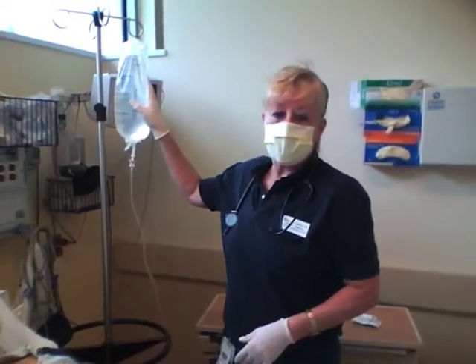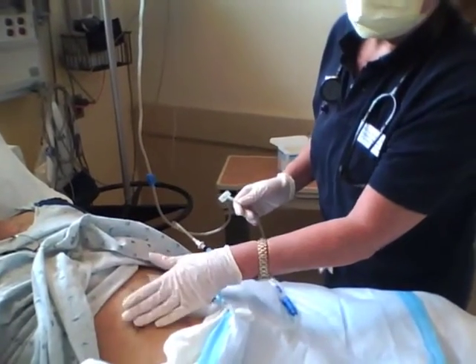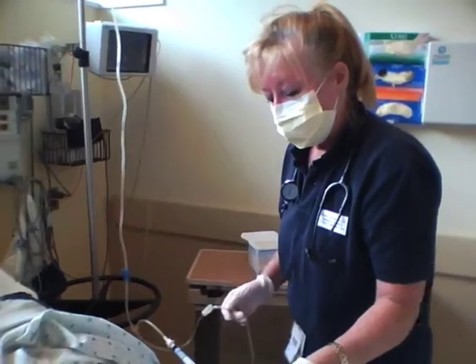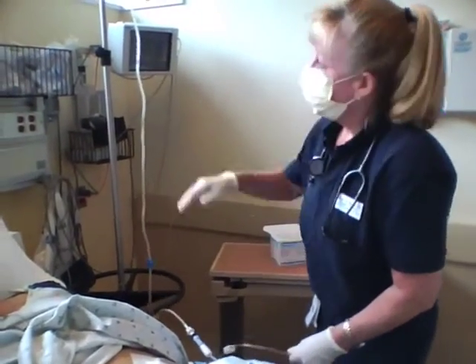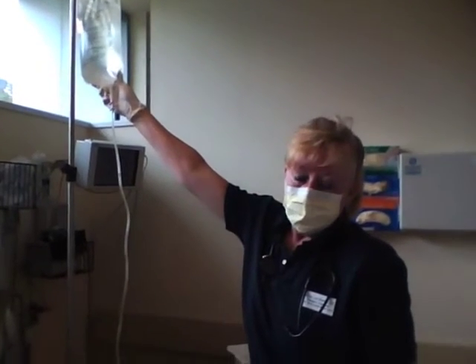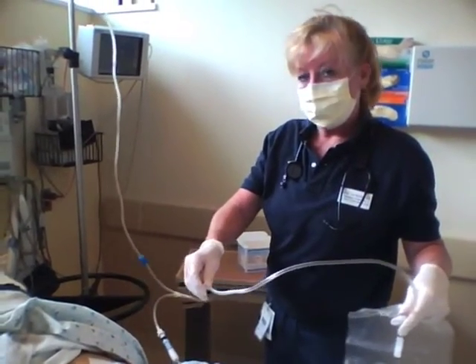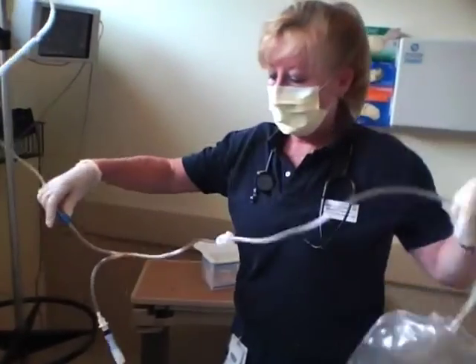Our patient only was able to infuse or instill 500 mLs of dianeal into his peritoneal space, and he probably reabsorbed that 500 mLs from last night. So trying to drain from his peritoneal space is going to be difficult because there's not going to be a whole lot in there. So what we're going to do now is instill our dianeal and let it dwell for a little bit, and that's how we're going to get our effluent for a culture to assess whether he has peritonitis or not. It's important to make sure that your drainage system is clamped off first before you open up your dianeal line — otherwise your dianeal is going to go right into your drainage bag.